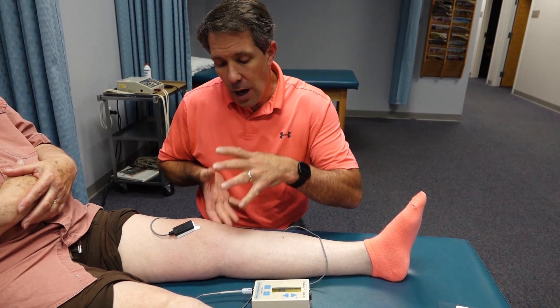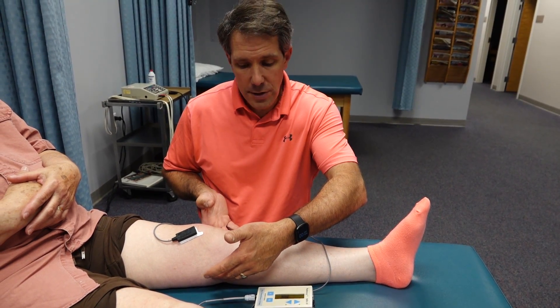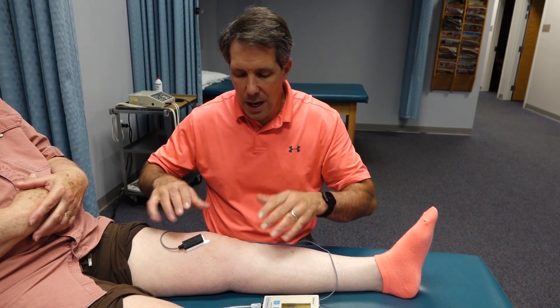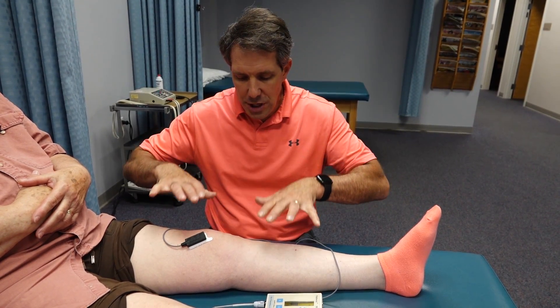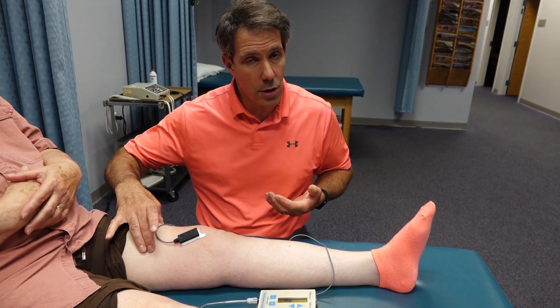Leslie here has an arthritic knee. She didn't have very good extension when she first came in, but we optimized that by heating her knee, stretching it out into extension, and now she's nice and straight.